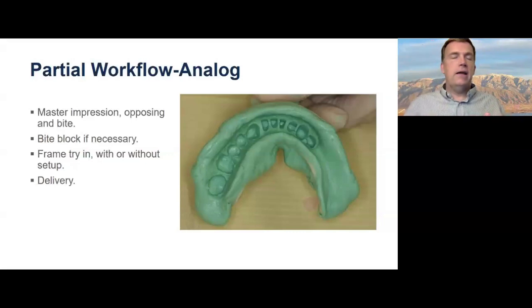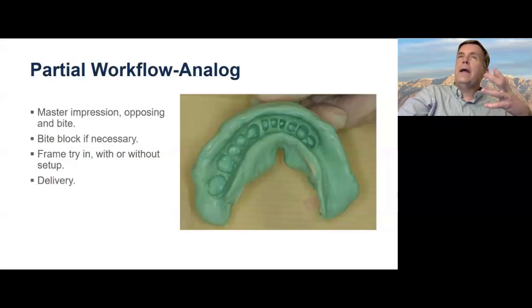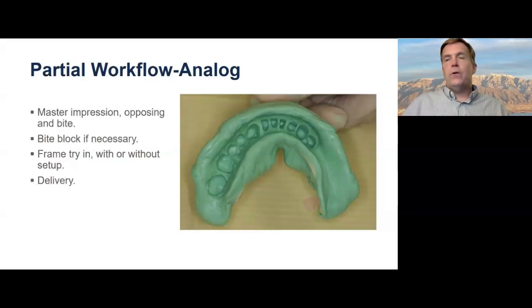You have to decide if there are aesthetic or functional reasons that you might need to alter the bite, alter the tooth position or whatever. And then your 4th appointment is going to be your delivery. As you know, if anything goes wrong, then you start adding appointments. But at the end of the day, even if you're doing 4 appointments with current reimbursement, a lot of times it's hard to make money doing these.